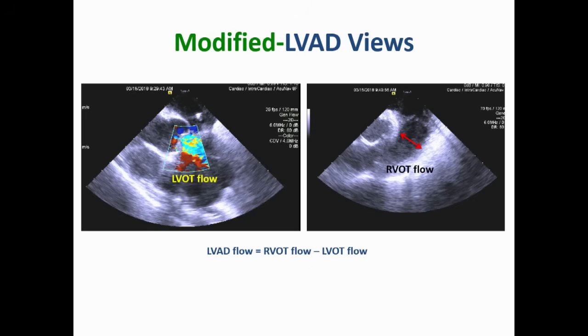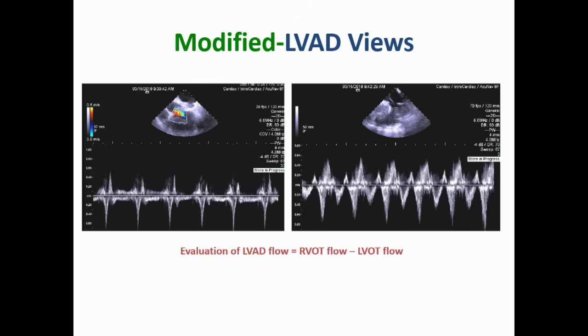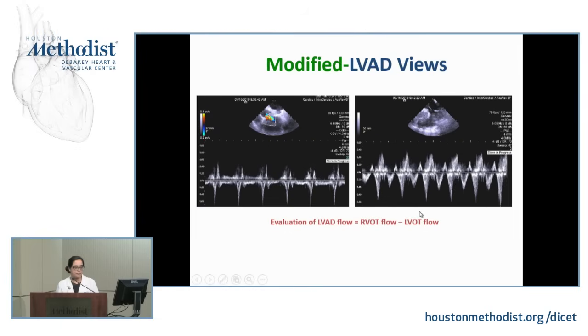And then, one of the things that I'm interested in looking at is some of the VAD flow, but it's not very accurate. But here we can see RVOT flow better. We struggle a little bit with echo sometimes getting the RVOT views. In ICE, you can get a good RVOT view, but ICE doesn't give you a good LVOT view. It can give you flow if you have aortic regurgitation, but you can't align the Doppler to get an accurate LVOT TVI through it. See how this TVI looks. It's probably not angled correctly, but the RVOT is perfect.